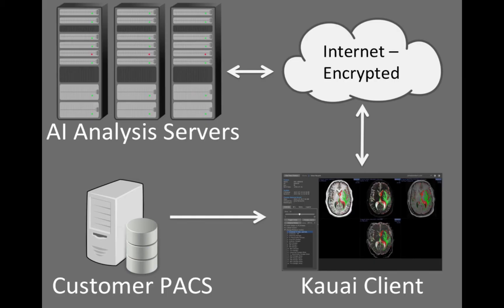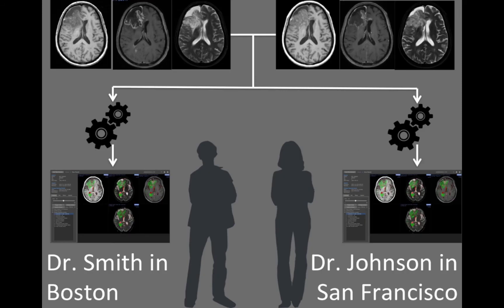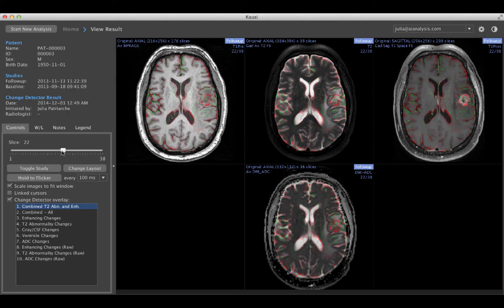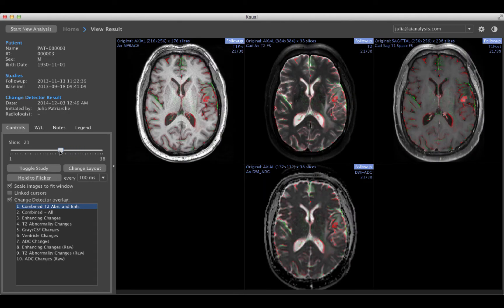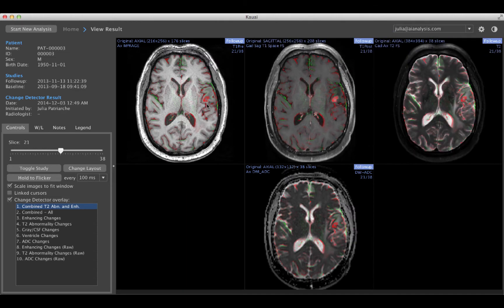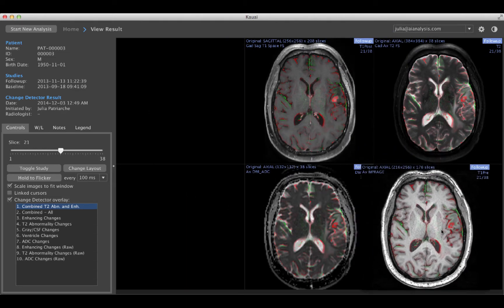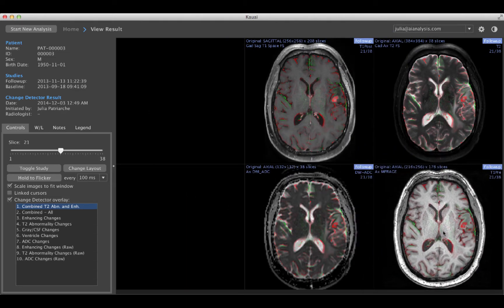The Kauai Change Detector system interfaces directly with your PACS. The preparation of images for radiologist review is fully automatic, fully reproducible, and blends seamlessly into your workflow. The user interface uses a lightweight client that is smooth and responsive. You can tailor the presentation to how you prefer to work.